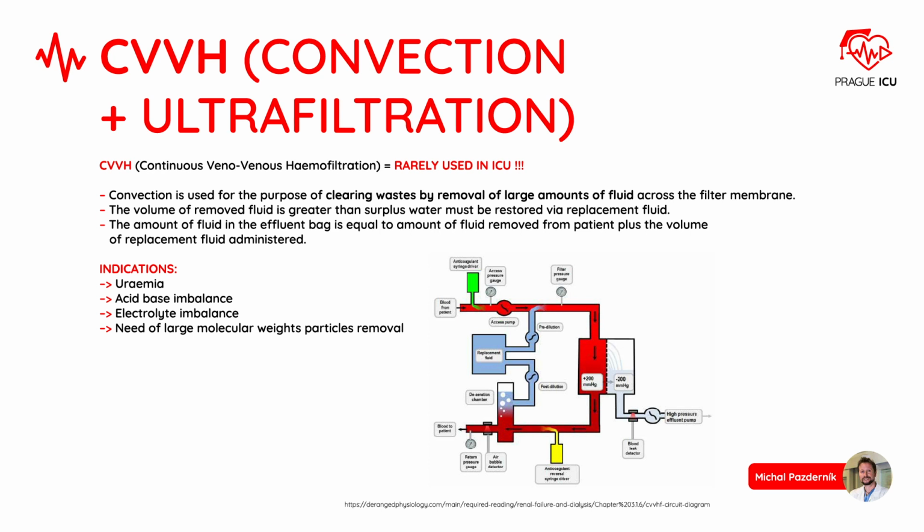The amount of fluid in the effluent bag is equal to the amount of fluid removed from the patient plus the volume of replacement fluid administered. Indications include uremia, acid-base imbalance, electrolyte imbalance, or need of large molecular weight particles removal.